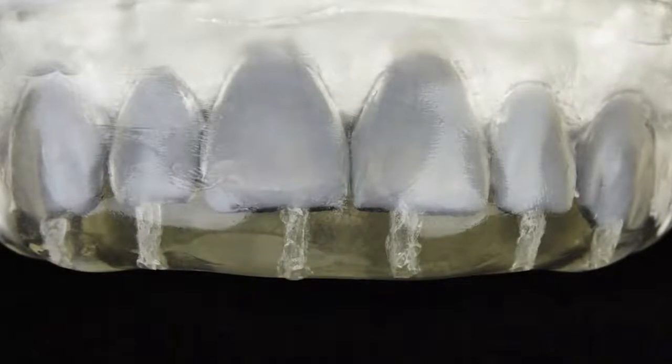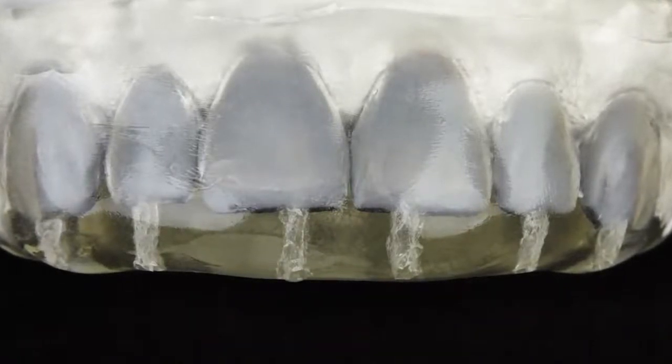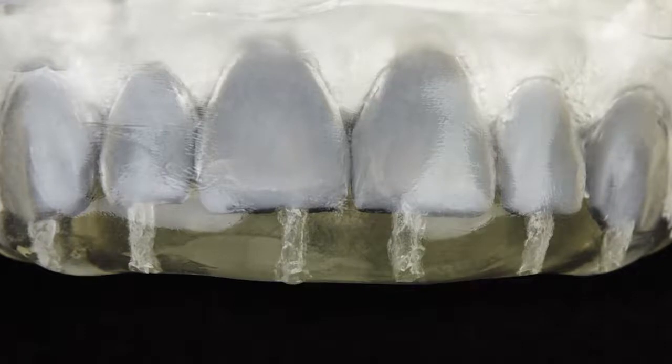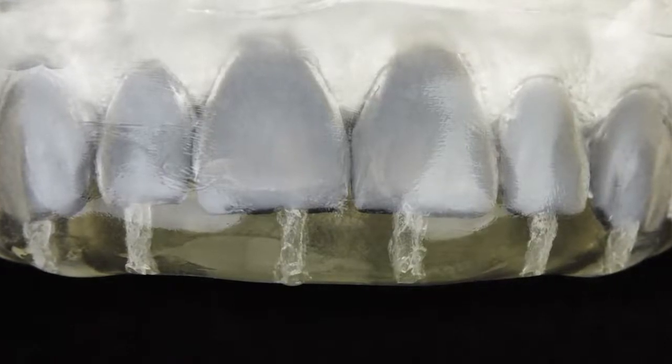The completed clear polyvinyl siloxane matrix. This clear matrix can be placed intraorally over the prepared or unprepared teeth and used as a transfer vehicle for the flowable resin composite to be injected and cured.